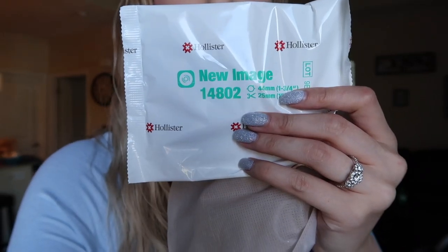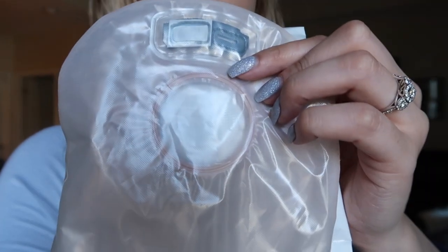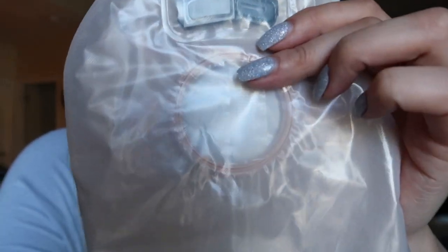So what I'm doing right now is I'm just gathering the supplies for Keegan's ostomy bag change. It's really simple. This part just goes onto his skin. This part goes on to the part that goes onto his skin.